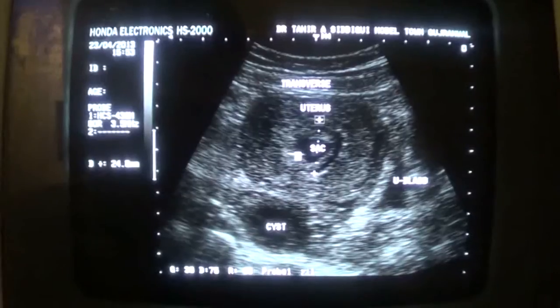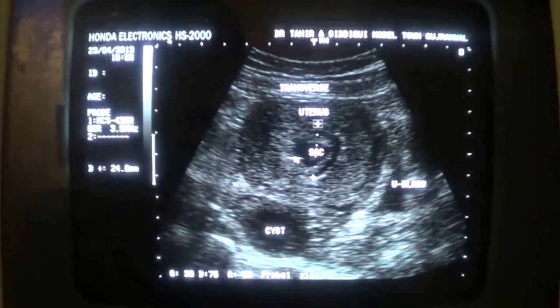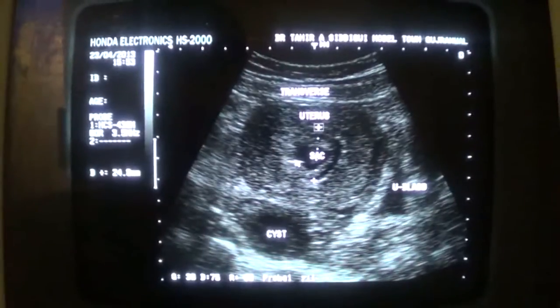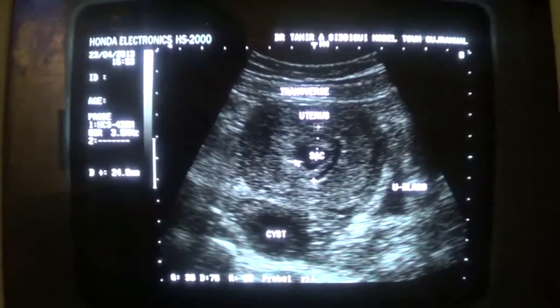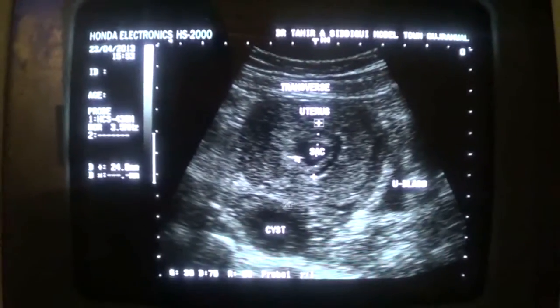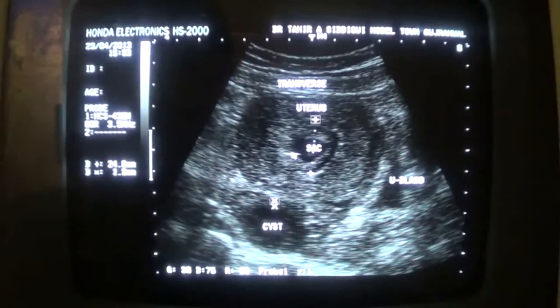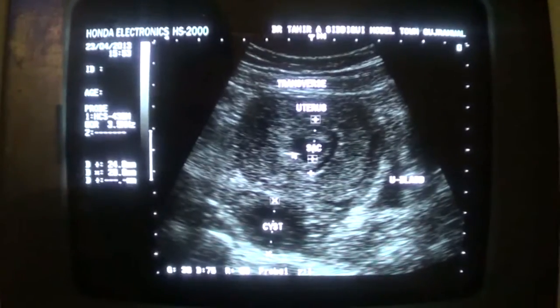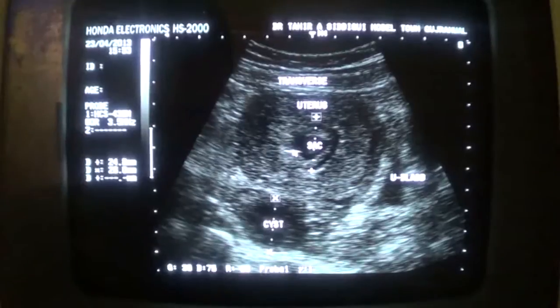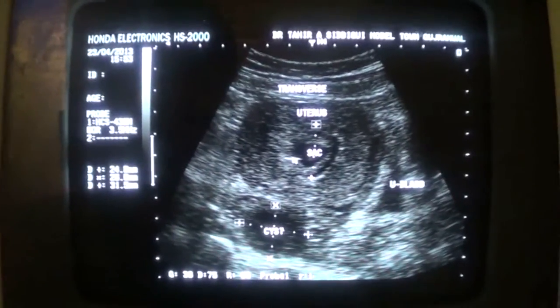And this is the echogenic particle, the bleed. It is not as shiny, or the calcification is not as shiny as what you are seeing in the view in front of you in this scanning plane.